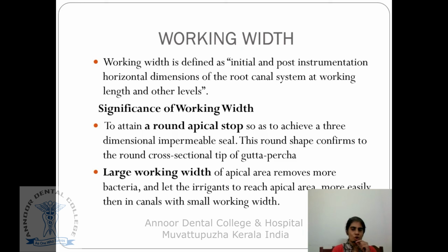Moving on to another small terminology called working width. Working width is defined as the initial and post-instrumentation horizontal dimension of the root canal system at the working length as well as at the different working lengths. So the initial width will not be the same as the final width. So why should we know about the working width? What is the significance of a working width?